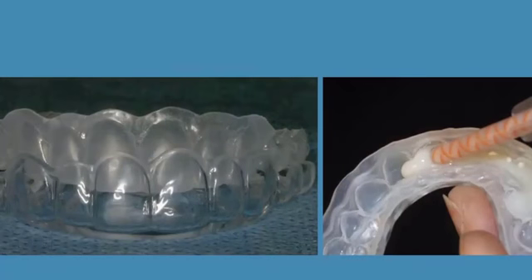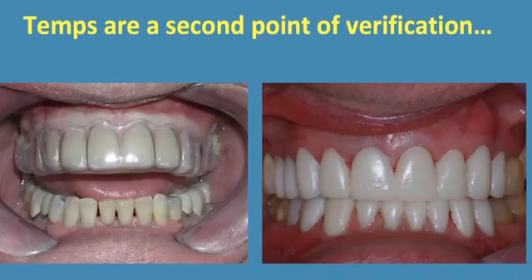So this is our template, and this is used for making immediate temporary restorations in the mouth. Basically, it's a double suck down, hard, soft layer. Think of it as a metal impression tray with removable impression material. So you load that up with bisacryl or acrylic and squish it in the mouth, and let it set. That hard outer shell doesn't flex, so the material doesn't distort. And so you end up with a very accurate replication of what the diagnostic wax-up showed as temps.